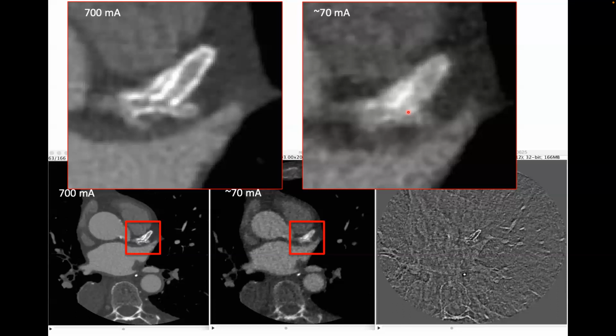Okay, and that's not a scalable concept, like to a full-size CT? It's not scalable to a full-size CT in the sense that the geometry of a full-size CT is kind of fixed with a meter-wide bore. If you wanted to do that, you would need a much larger bore, and your source has to be close to the sample, so it would be sort of an asymmetric thing.